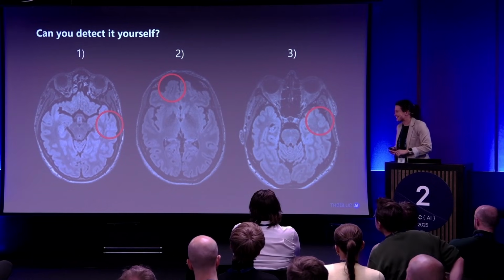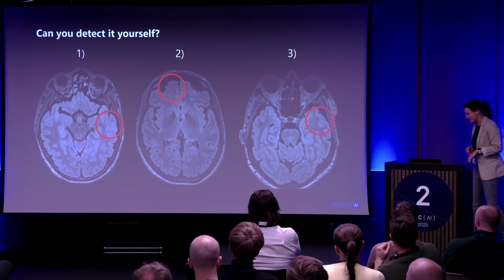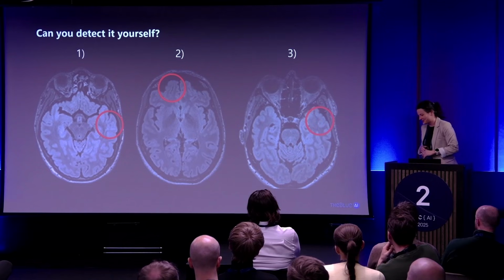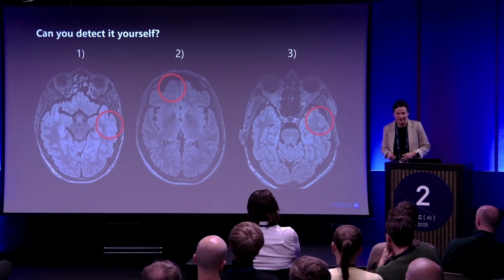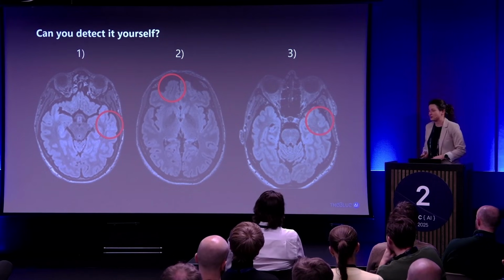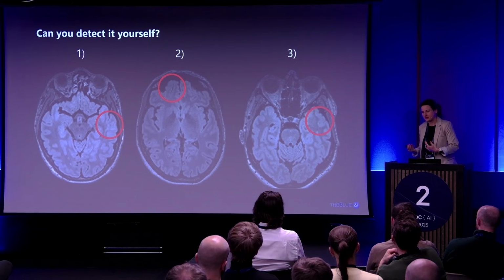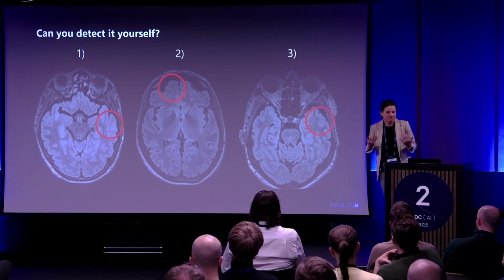That was a tricky question. But as usual, in real situations FCDs are not so clearly visible like in the books or like in the examples that I've shown you before. The reality is much more complicated and it's really hard to find them. I mean, ourselves, even though we worked quite a lot on the technical side of this project, we're not able to recognize them at the level that the doctors do.